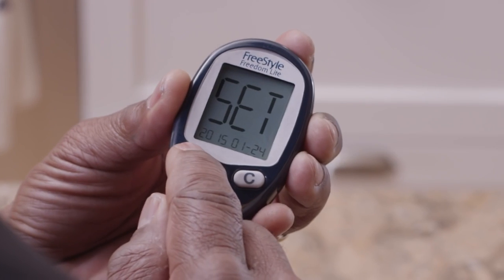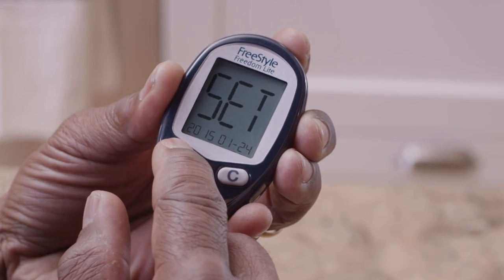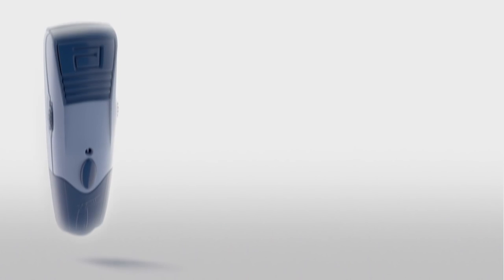Press and hold M for 3 seconds until the meter turns off. Congratulations! Your meter is now ready to use.